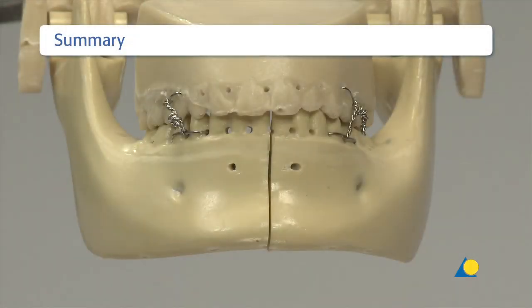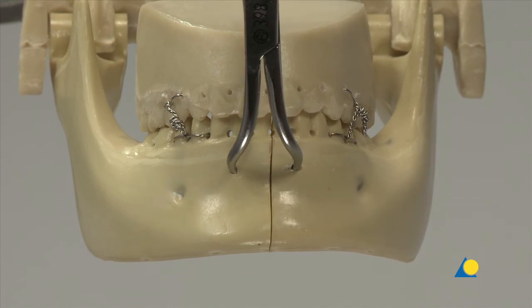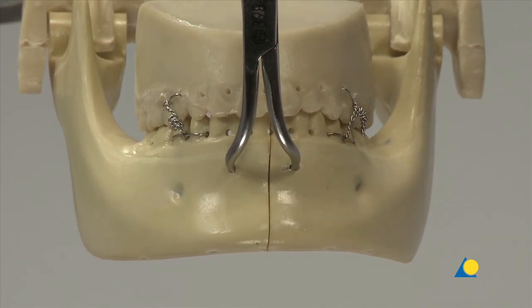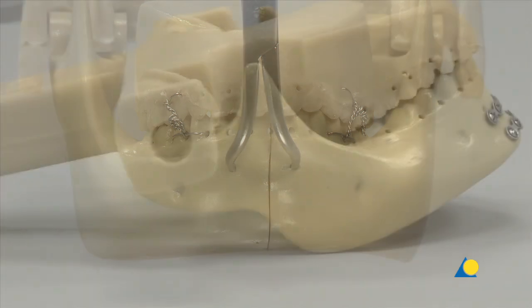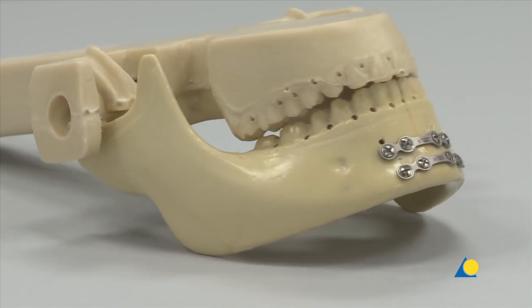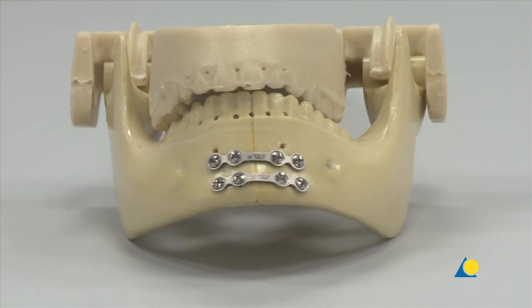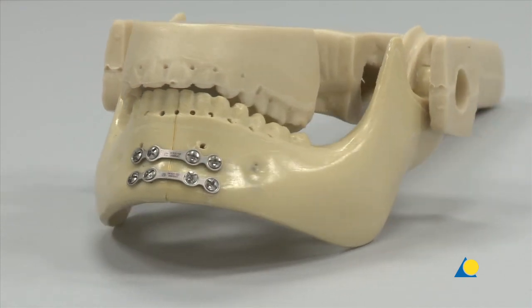This presentation has shown the importance of correct occlusion and anatomical reduction to reproduce the original shape of the mandible before fracture fixation, and the correct technique for applying two 1.0 mm thick matrix mandible mini plates. Although this method of fixation is stable and technically non-demanding, it is not as stable as lag screws or compression plating.